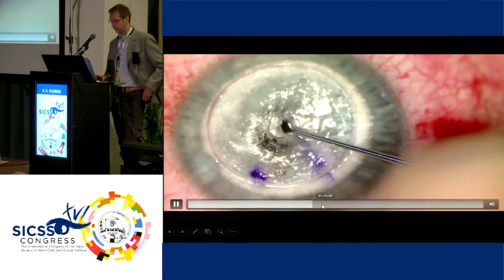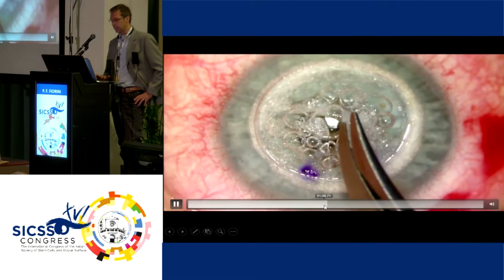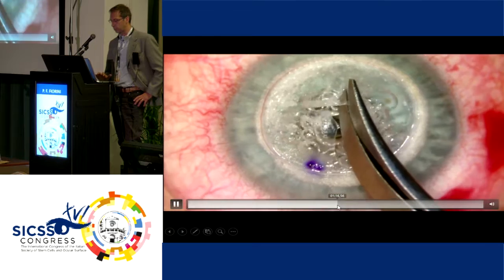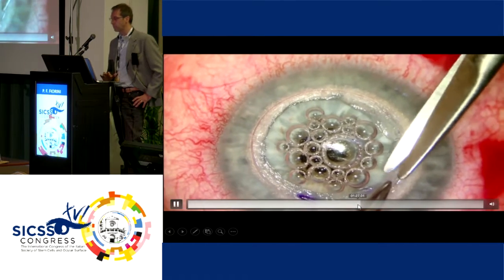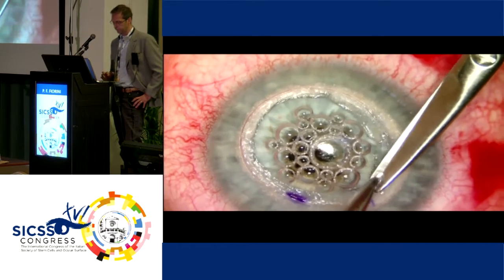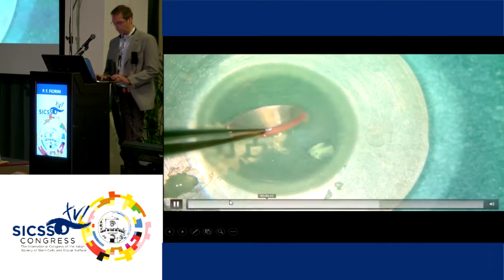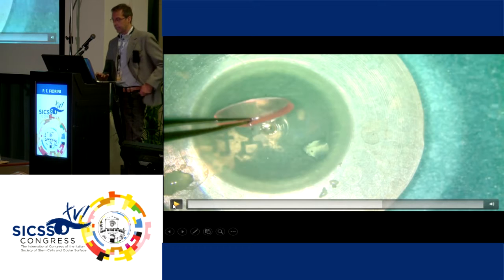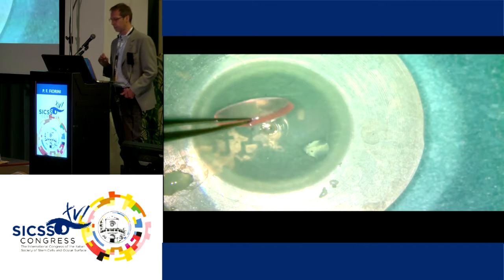So the cut is widened with a spatula. This spatula was designed by Dr. Fontana, and then the remaining part of the surgery is just as usual, and then we finish it, or we trim it. This is another key step in the procedure, because the previous step brings to this step, that is to say, a really perfect lamella being created.